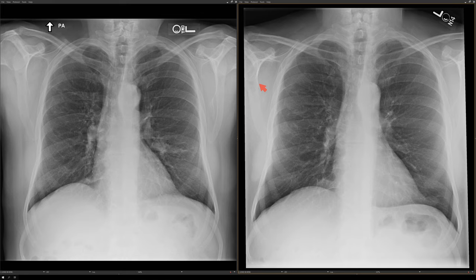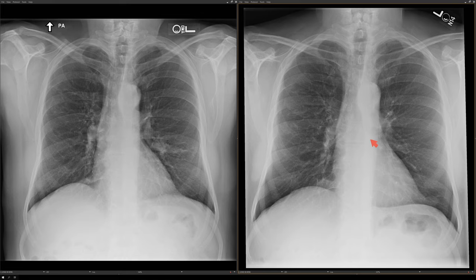There are a couple of abnormalities I want to point out on the current chest x-ray. One is that there's an area of reticulation here in the right upper lung, and the second is that there's this elongated opacity in the left lower lung. You can see on the comparison that the area of reticulation was present two years ago; however, the elongated opacity was not there.